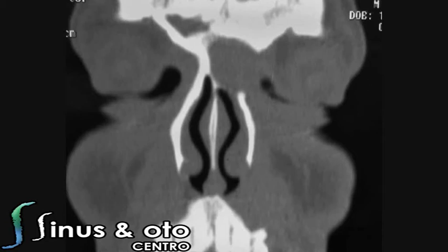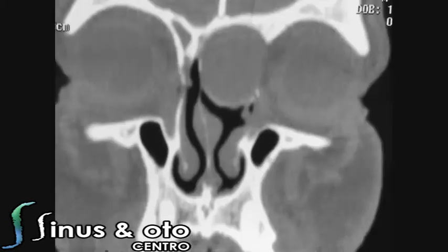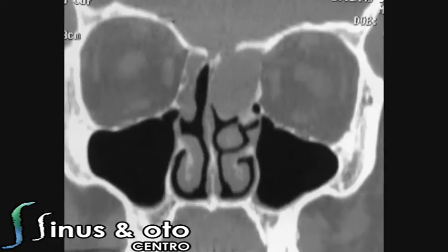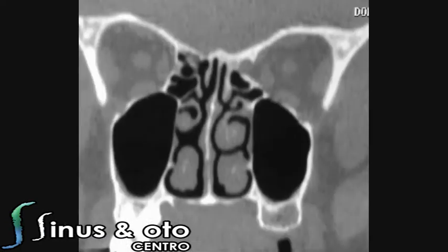Hello, this is an edited movie showing an endoscopic marsupialization of a mucocele of the left side nasal cavity. As you can see on the CT scans, there is a large mass on the ethmoid region. The lamina papyracea of the left side orbit seems to be a little bit eroded, and the skull base also seems to have a defect.